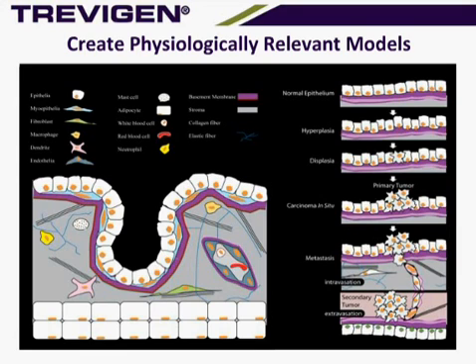And in our assays, we use tissue extracts. So these are proteins that are extracted from the tissues from animals, and this provides a better or more biologically active matrix for these cells to grow and invade into.